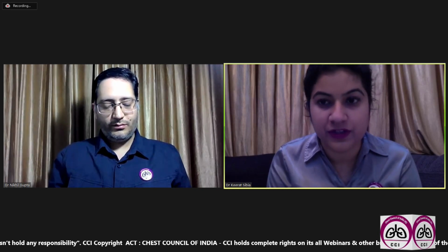I think it's a very valid question. We commonly come across such cases in the OPD when the patients come back on follow-up. An important point that Dr. Bijal has given us is that the patient is clinically doing okay. So if the patient is not a smoker or diabetic, or at high risk for any uncontrolled infection or malignancy, she may ask the patient to come on follow-up and get a repeat chest X-ray at 6 weeks, following up the patient for another 4 weeks. Or she could go in for, as you added, a low-dose HRCT. That's a good tool at our disposal.